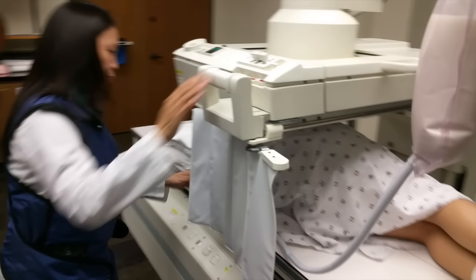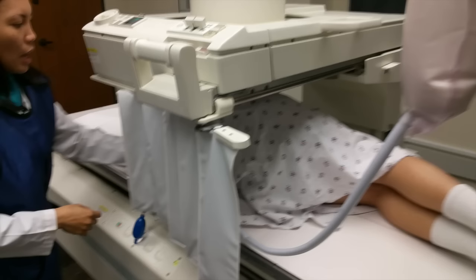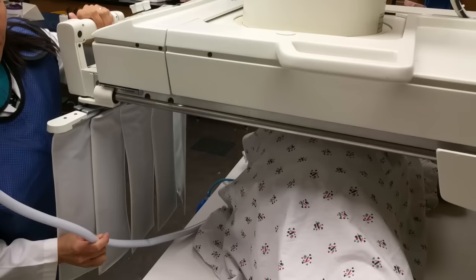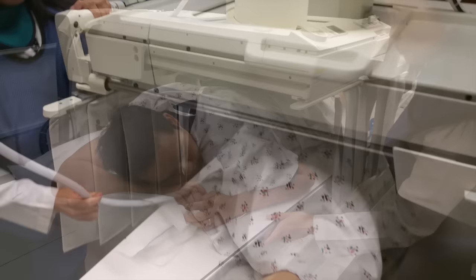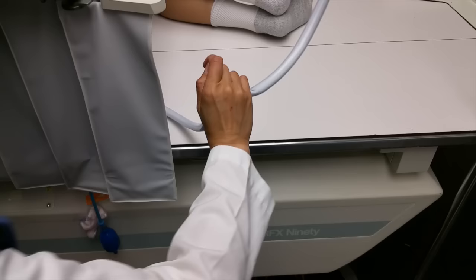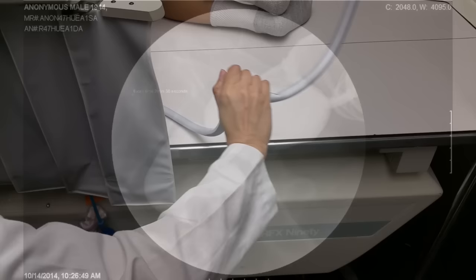The patient is usually in somewhat of a left lateral position after the rectal tip is placed. I like to take a quick look at the tip in position, especially if a retention cuff is used, to ensure it's in the proper position and the cuff isn't over or under inflated. Bring the image intensifier or flat panel detector close to your patient, since this reduces the dose to the patient, to you, and to the technologist. The patient is traditionally placed in the prone position to administer the barium, although in some indications the exam should begin in the left lateral position. I like to control the barium flow by unpinching the tube with my right hand, while watching the monitor and controlling the image intensifier with my left hand.